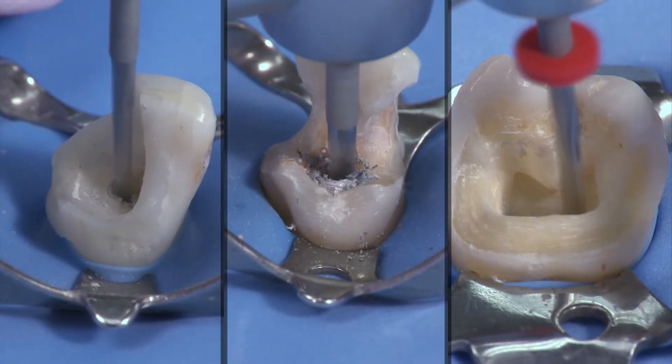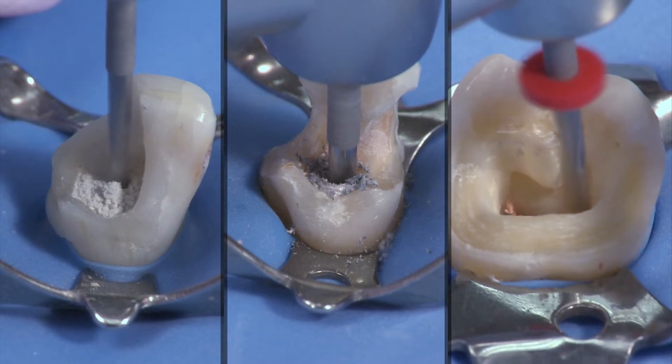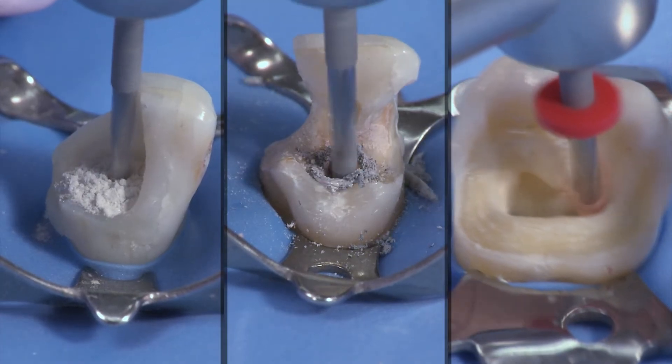The Unicore drill is unique in its ability to remove post or plastic core obturators. There is no need to purchase separate drills. You only need one Unicore drill for each preparation.